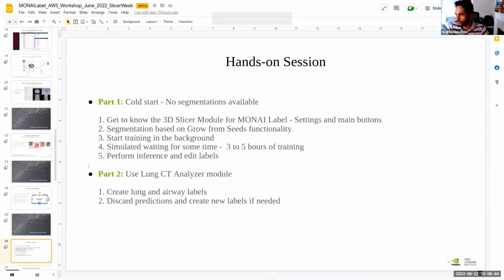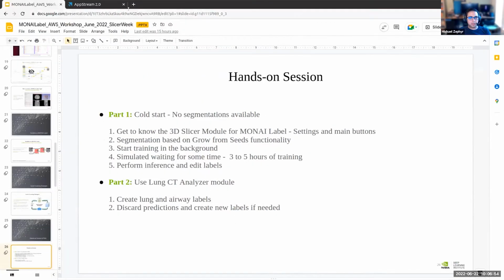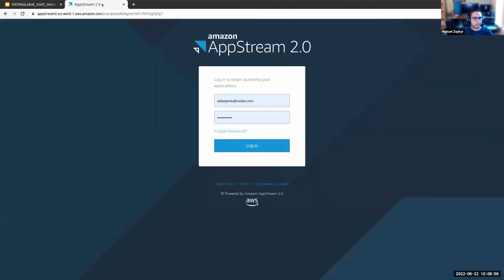Okay, great. So let's go to the. And Andres, there's two questions here in chat really quickly before you jump over. One was asking, what workflows does MONAI Label support? Is it just segmentation? And then do we support multi-class or two-class classification as well?